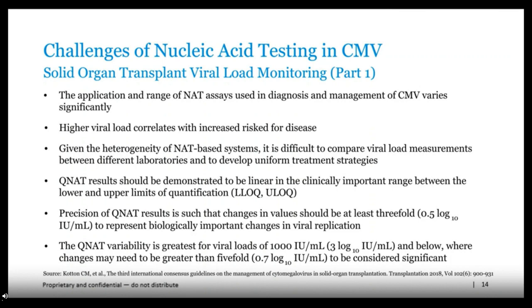Higher viral load correlates with increased risk for disease, but given the heterogeneity of nucleic acid-based systems, it is difficult to compare viral load measurements between different laboratories to develop uniform intervention thresholds or treatment strategies. So really, the particular clinical site and the various assays that are used across clinical sites need to be taken into account when thinking about developing thresholds for intervention.